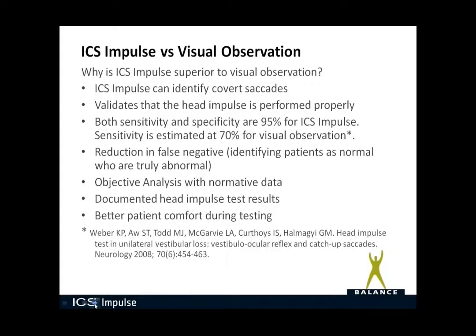Objective analysis with normative data. It's documented head impulse test results. So you have documentation that the test was done and this was the results, instead of just a handwritten note, which you would have with visual observation.